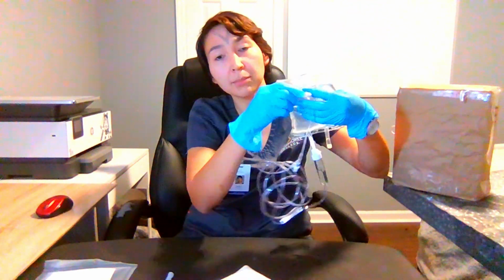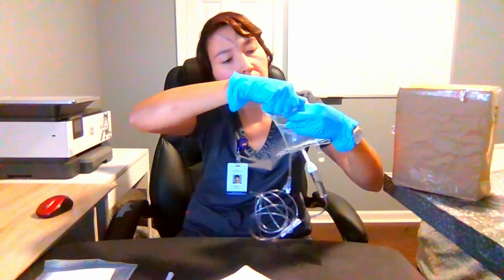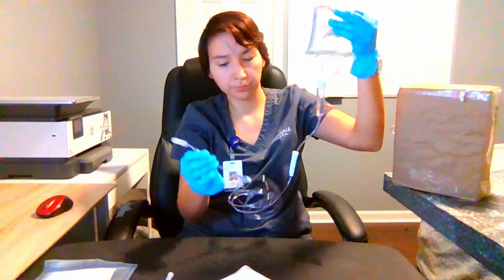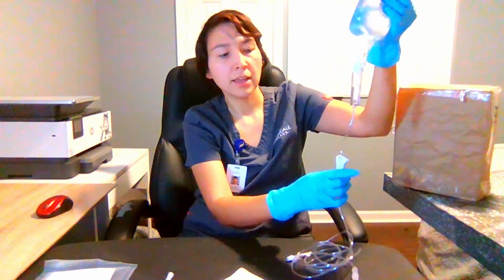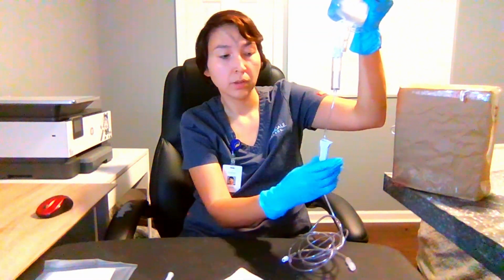Remove the adapter cap. And gently open the roller clamp to allow a few drips to go through.